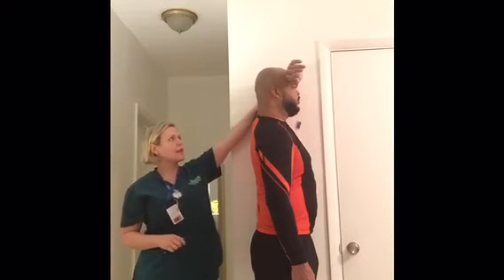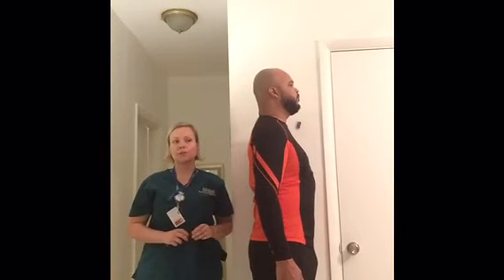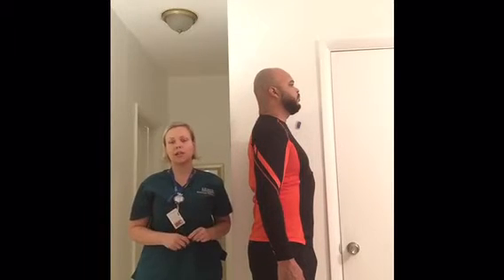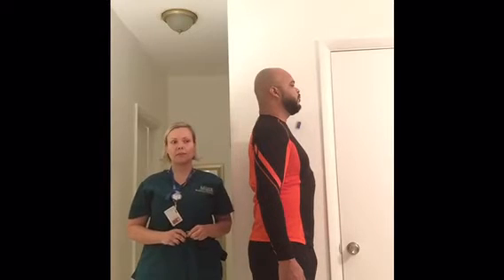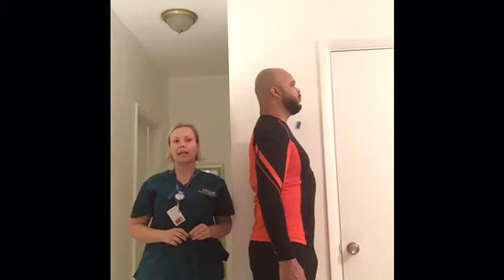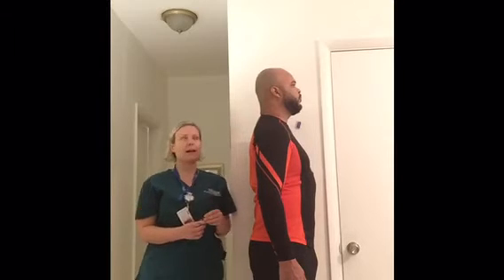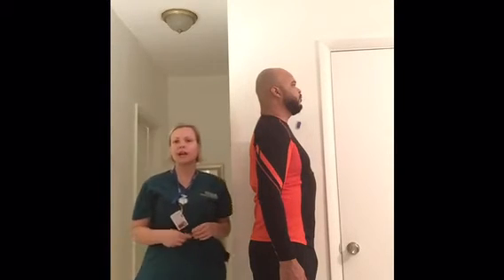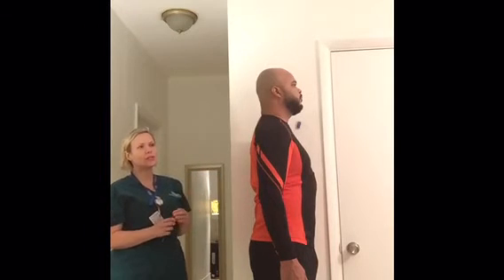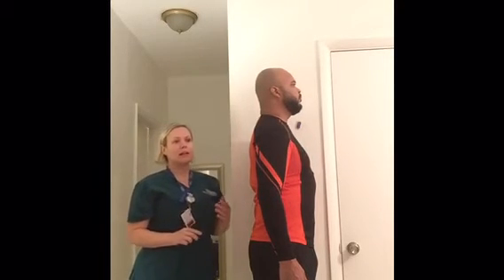Now we're going to ask your patient to relax your shoulder, put it down. We're going to do flexion extension. We use this position usually for mobility, to make sure that everything is alright after surgery, and the patient is recovering. That way you can make sure that the mobility is proper, and how the intervertebral spaces are functioning, how the inflammation is. Sometimes it is used for arthritis as well. The technique used for flexion extension will be the same as the lateral.